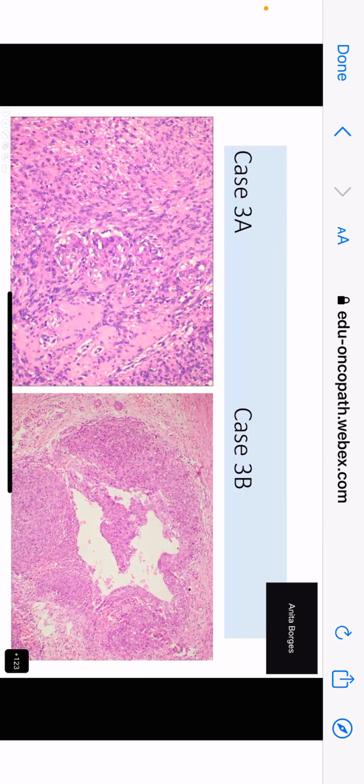You see these vessels that are almost showing you what you see in glioblastoma. That's endothelial conglomerates. Yes, glomeruloid microvascular proliferation. Exactly. Microvascular proliferation is being seen. And you see these cells here, the nuclei looking round. Why? Because it's a fascicle that has been cut at right angles.